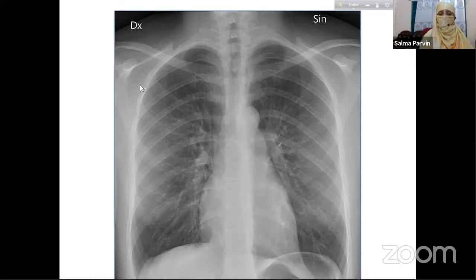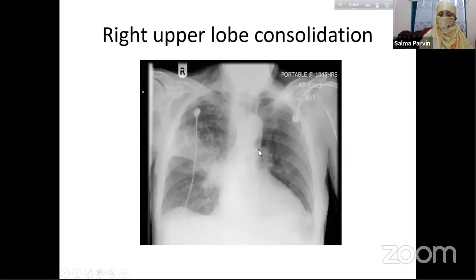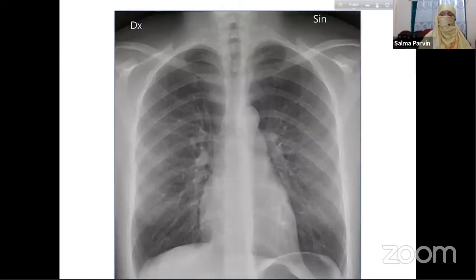So the vascularity you can trace like this, the pulmonary artery descending on both sides of the cardiac shadow, the arteries dividing into branches. This is the normal scenario of a normal PA chest X-ray. Keep these normal chest X-ray findings in mind very clearly and precisely, so that you can recognize any pathology in the normal field and predict it nicely.